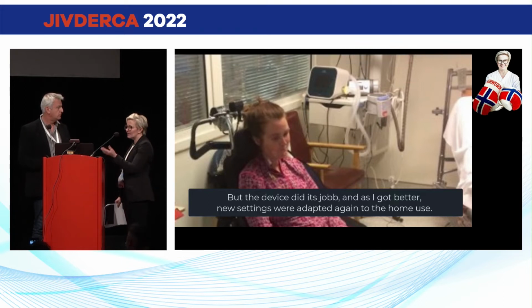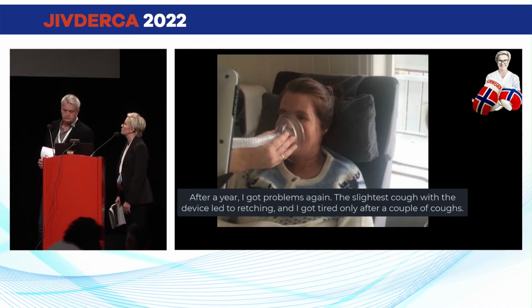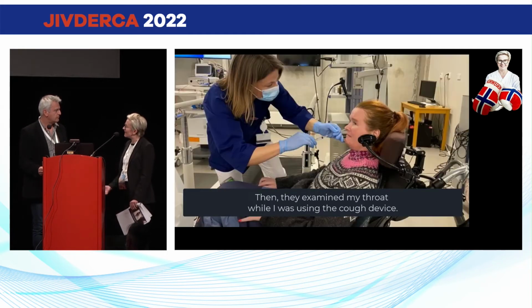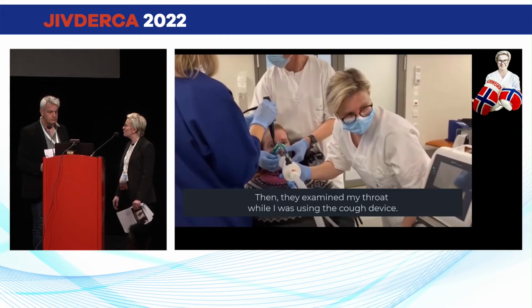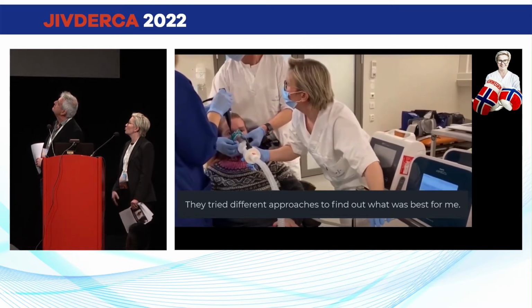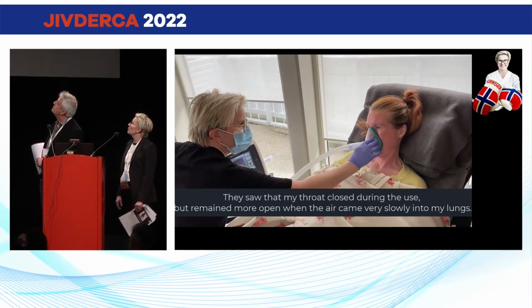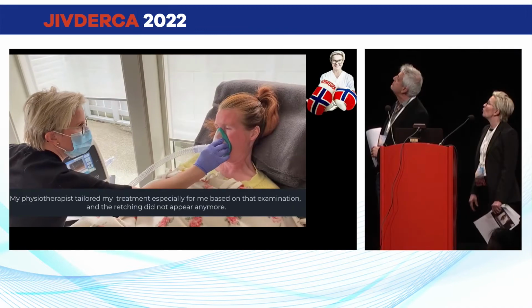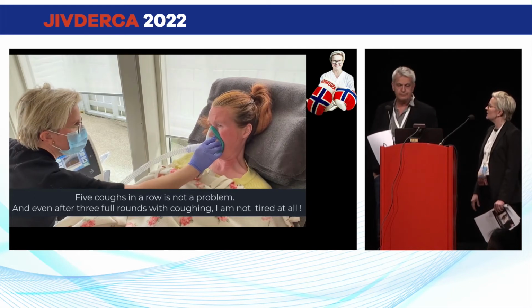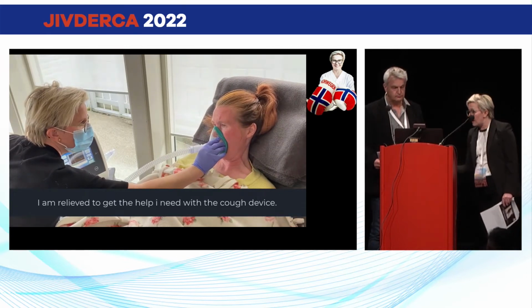Oh, Michel, you need to see this patient. She is a patient with ALS. She started treatment during her illness. It was really challenging. During pneumonia, we individualized the settings every day during the hospitalization, and she was in our unit 30 days. She traveled home with new settings, managed to use the device 1 year, and then it stopped. She started retching during MIE. Then we visualized the upper airways and tried to find what is more beneficial. And see, this is the latest video from her from this summer, and she still manages to use the device. Here's another patient.